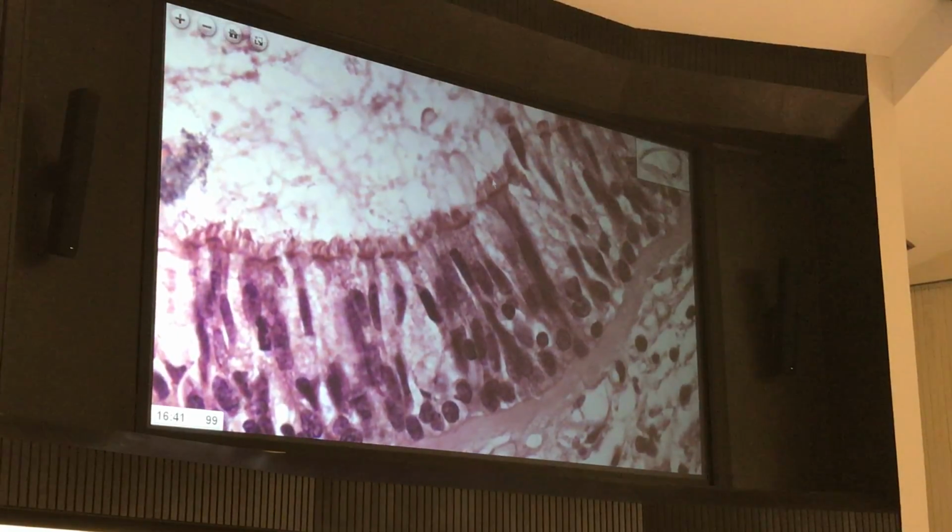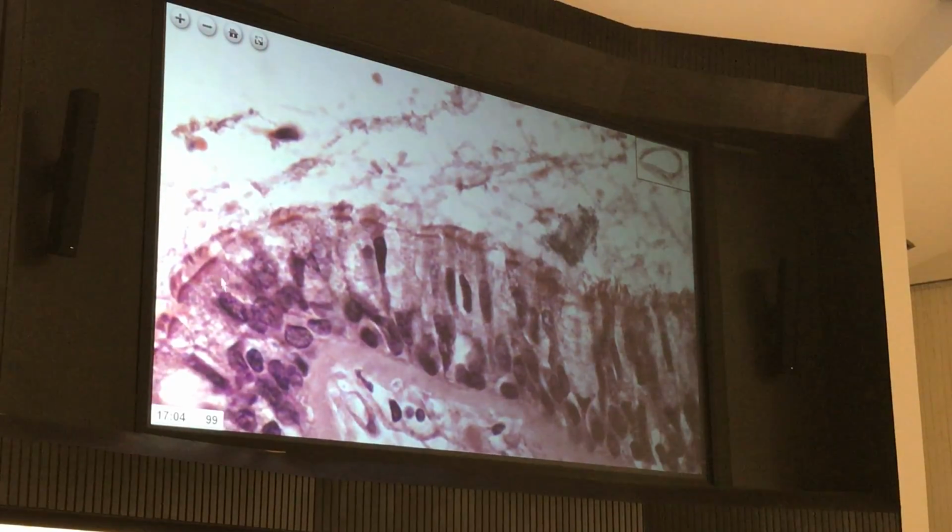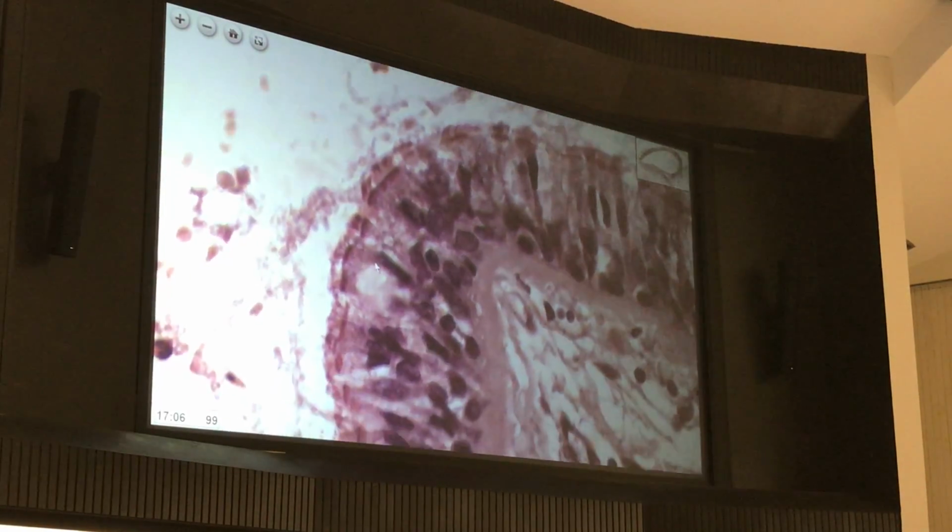Little, very regular size little bristles. Not microvilli. Microvilli we won't even see. All we saw was that pink line. We didn't see individual ones. What are these? Cilia. When you see these really regularly sized bristle-like structures, these are all ciliated cells. Not all of them.